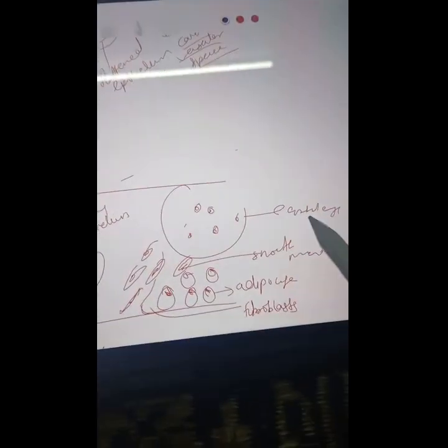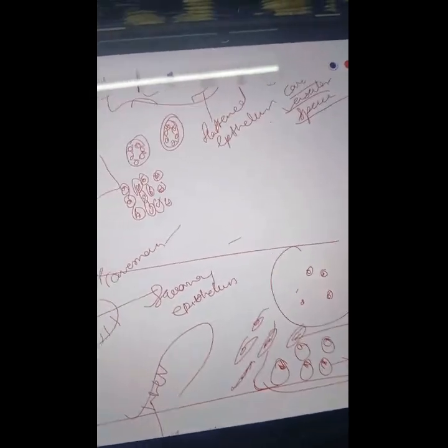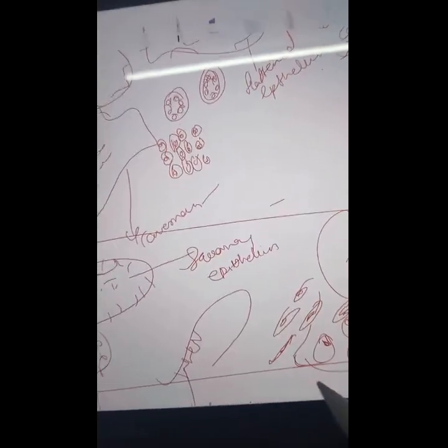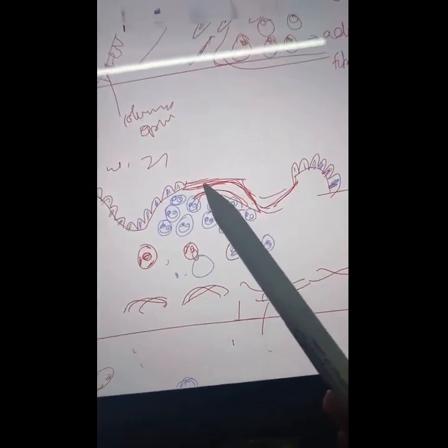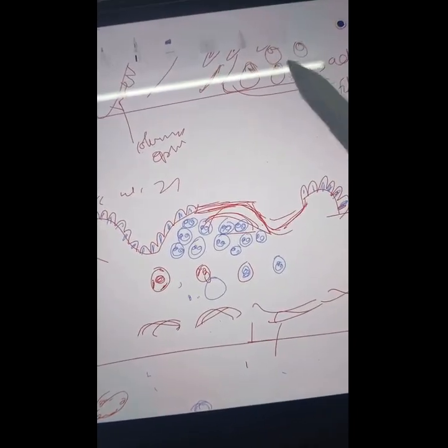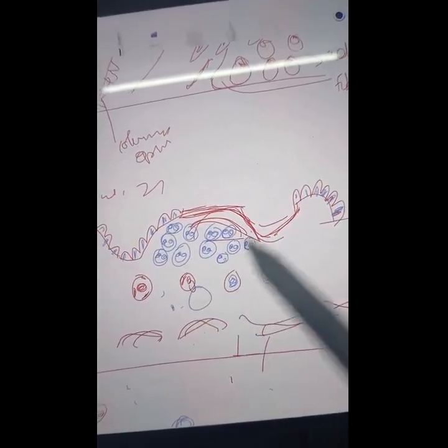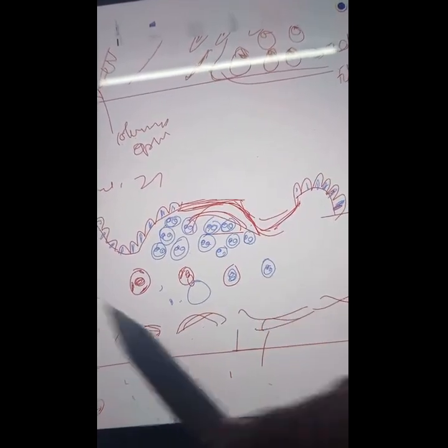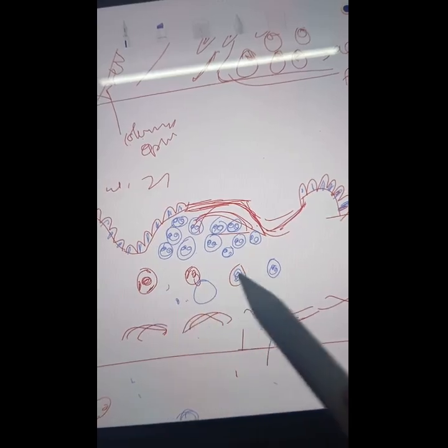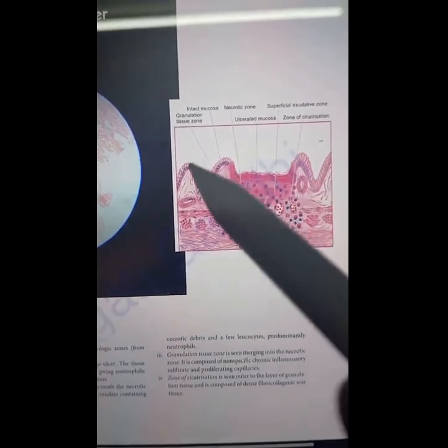You can see over here the early granulation tissue which is formed. Then there will be smooth muscle proliferation. You will find adipocytes and fibroblasts proliferating, which are important. Now, in chronic peptic ulcer you can see an ulcerated margin, loss of mucosa, ulcerated mucosa, and a lot of neutrophilic infiltration. Then you see the important cells, which are the granulation tissue component and fibroblast proliferation. The same thing is seen over here.